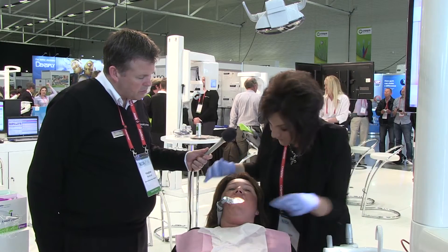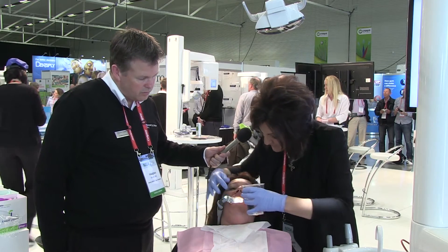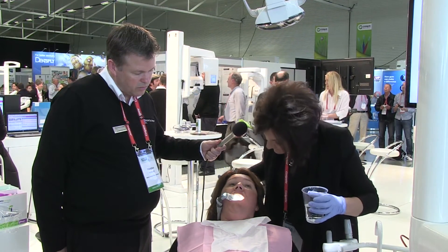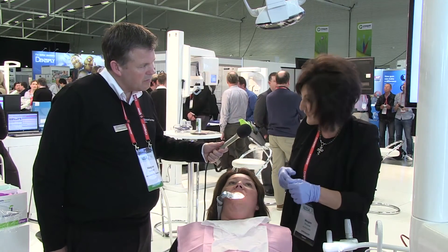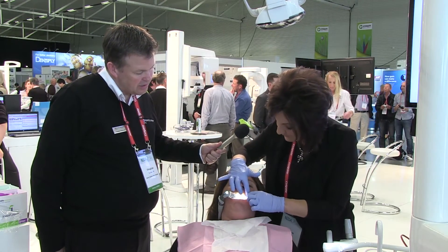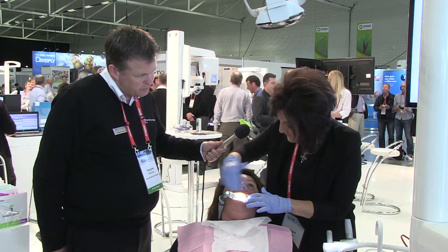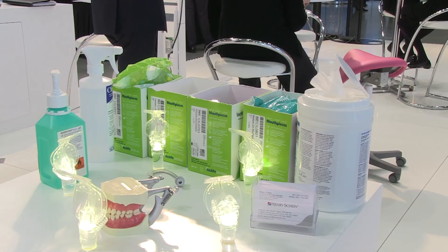If I pour some water into Kelly's mouth, you can see it drains away continuously — if I poured a significant amount in there, it'll just continue to drain away. That's a really important part. When clinicians are working, they can use the mouthpiece to rest the burr on and stop the burr. They've got complete obturation of the throat so nothing's going down there, and the illumination itself is pretty amazing.